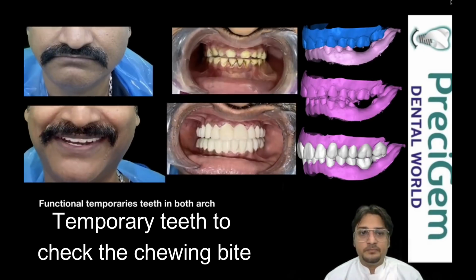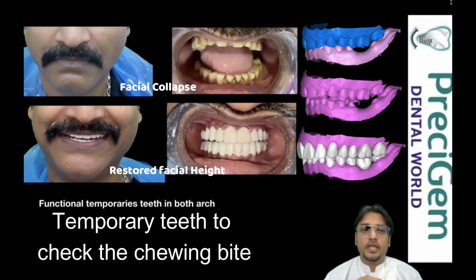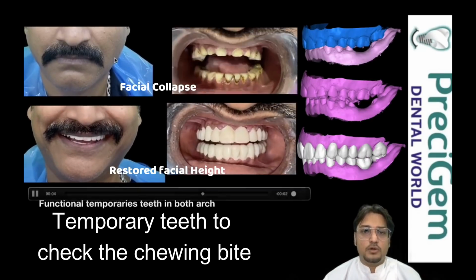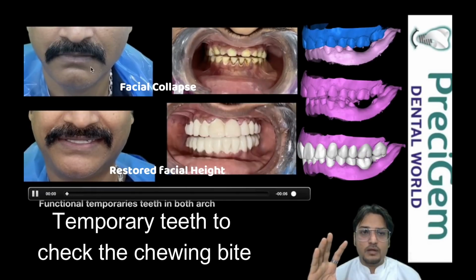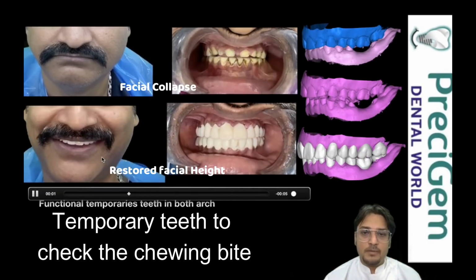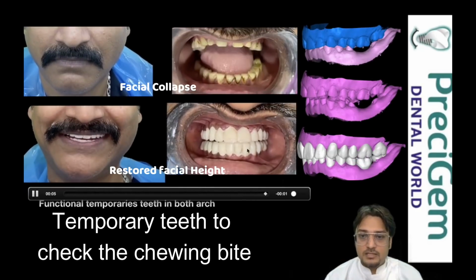If you see here in the upper one, the patient's facial height is collapsed. See, he is opening and closing. If you can appreciate his opening and his closing, his facial height is getting collapsed. Here it is not happening that way because we have restored his height.